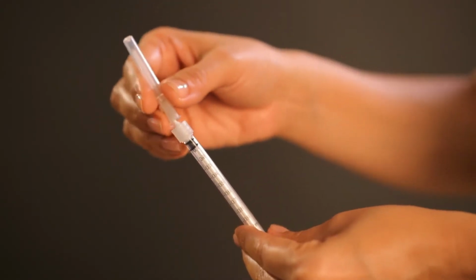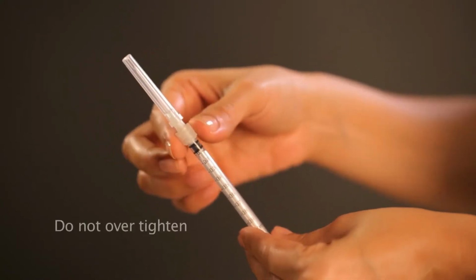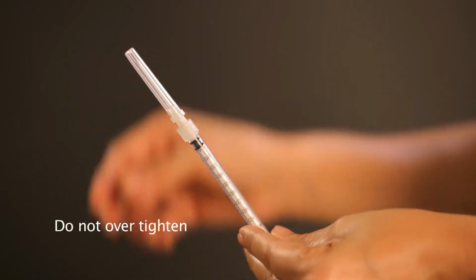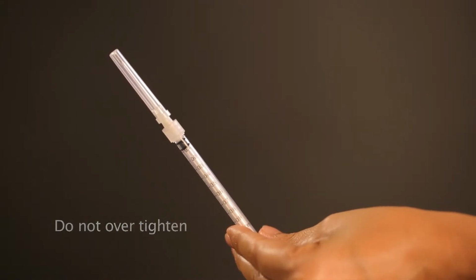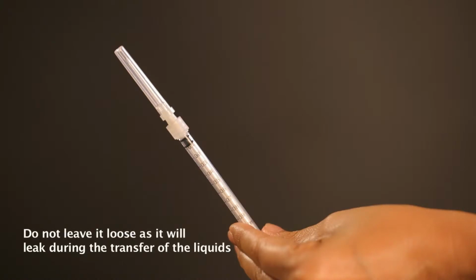Fix the draw-up needle on the syringe. Do not over-tighten the needle, as it may create difficulty in removing the needle. At the same time, do not leave it loose, as it will leak during the transfer of the liquids.